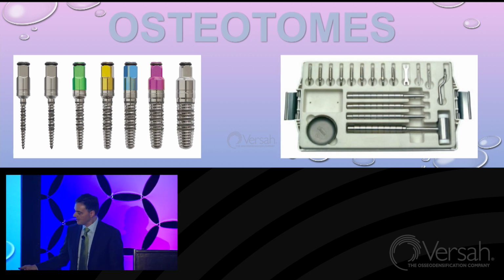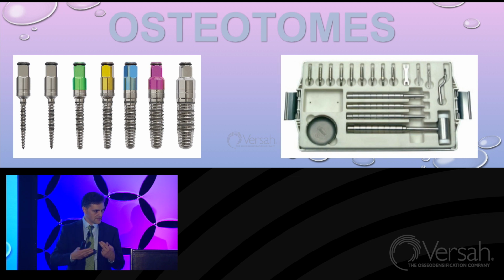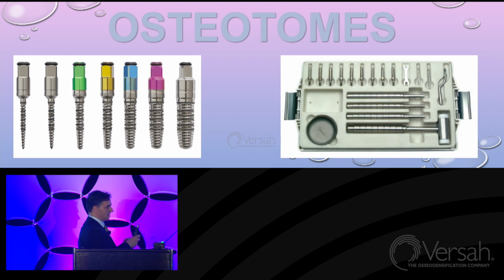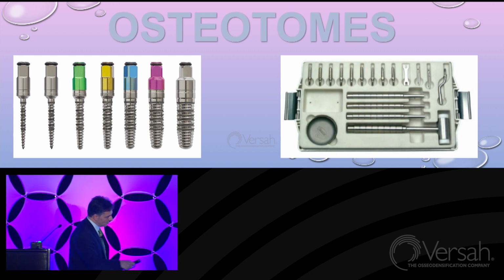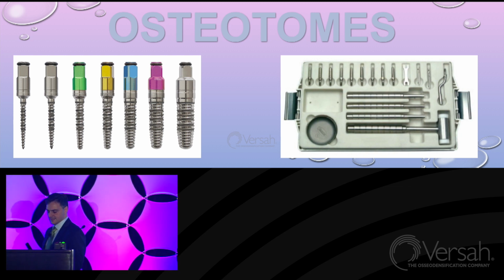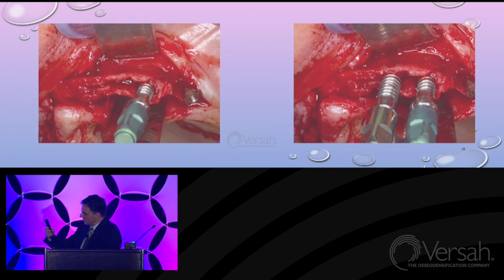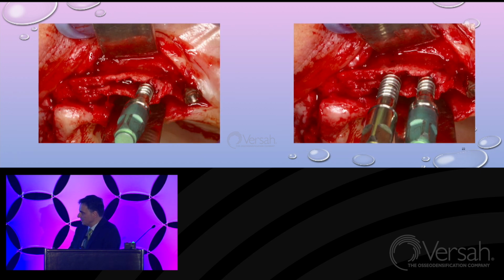Screw osteotomes are almost the same, can do the same job, a little bit more smoothly, and can progress gradually. You can control somehow the time and the speed. You can also increase the diameter, and it works very well for me, very nicely. You can expand a thin crest. You need some time to learn the technique, but you can expand the crest as much as you want.